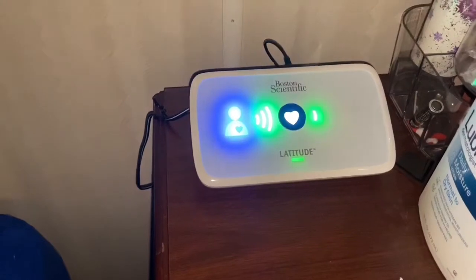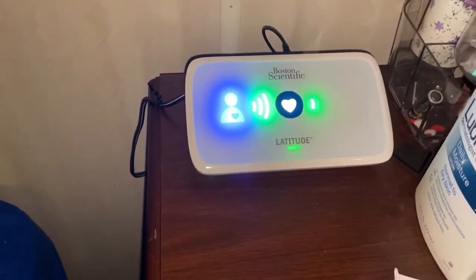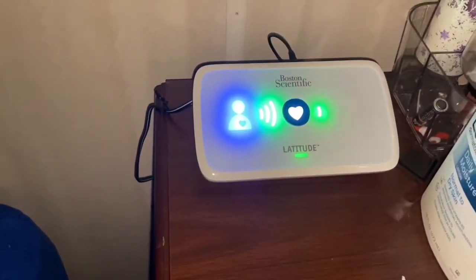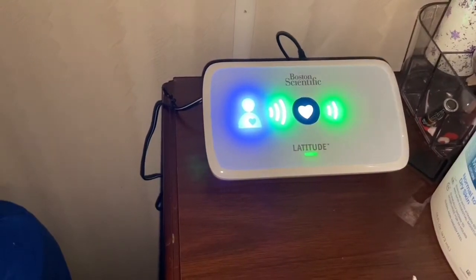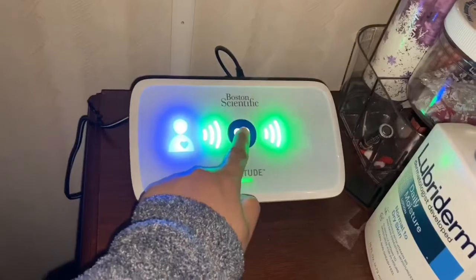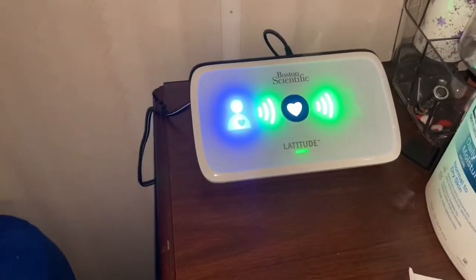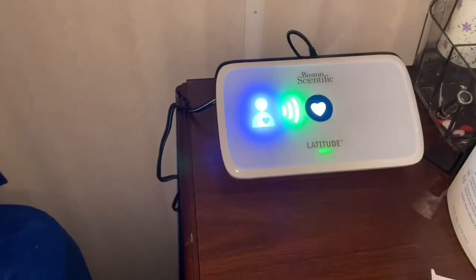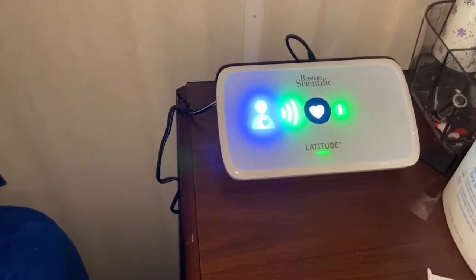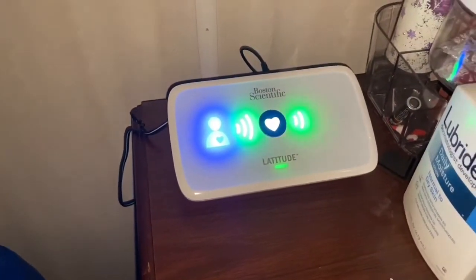So the next one, wait several minutes for the heart button to flash, and then press it again. You may have to press the heart button each time to flash. Okay, press, and then if the indicators are lit, as shown above, setup is complete. The lights will turn off automatically after 2 minutes.